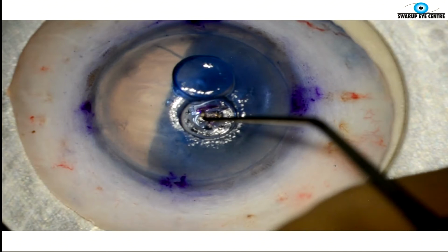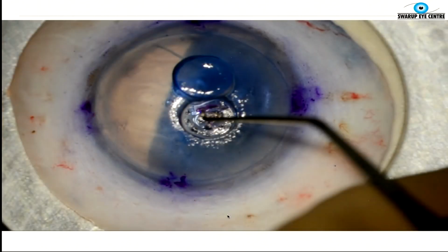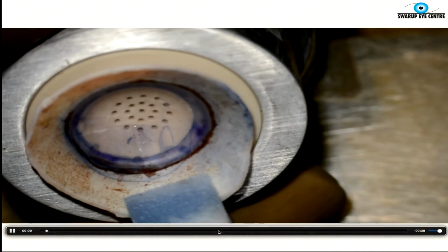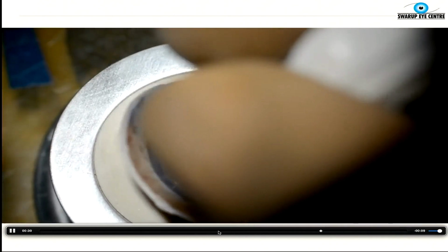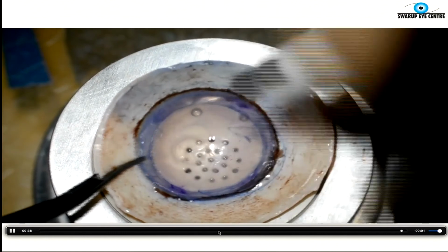And once you've done that, you put it back, you invert the graft, and I'm sorry, I think I skipped one video. So after you've stained the stripped area, you make a punch in the area where the Descemet membrane has been stripped off. And this is a small 3 millimeters or 2 millimeters window. You can use your keratoprosthesis trephine, or a dermal punch to create this little circular opening.